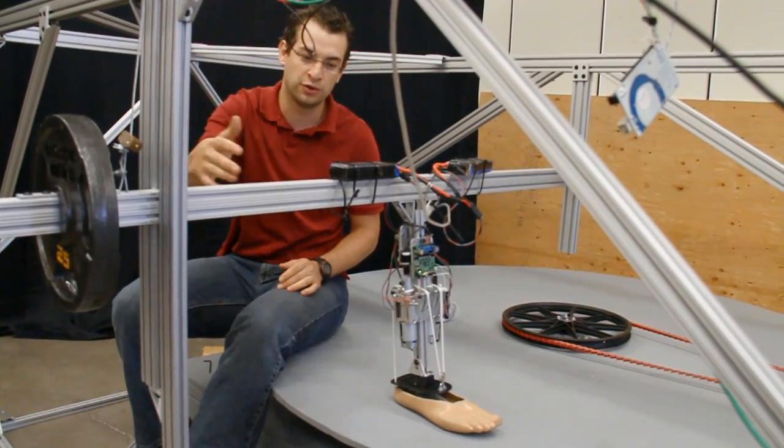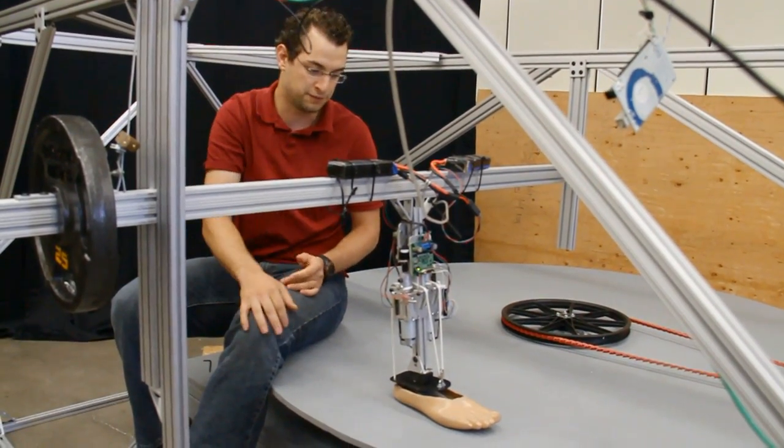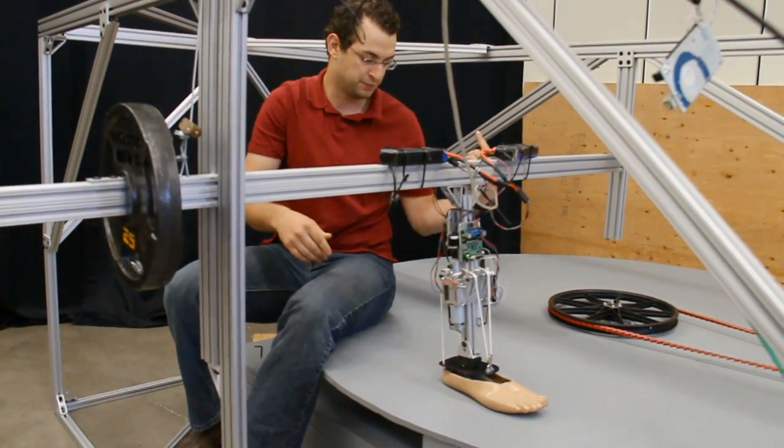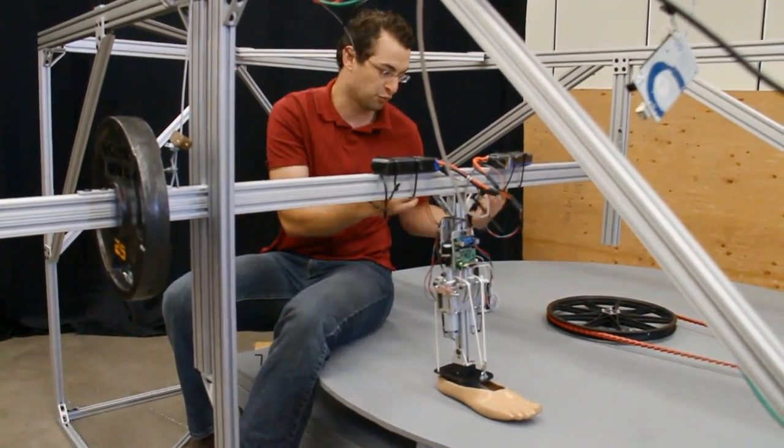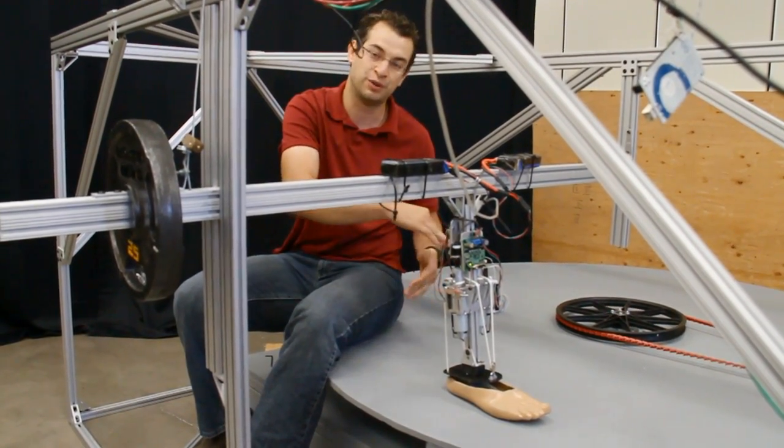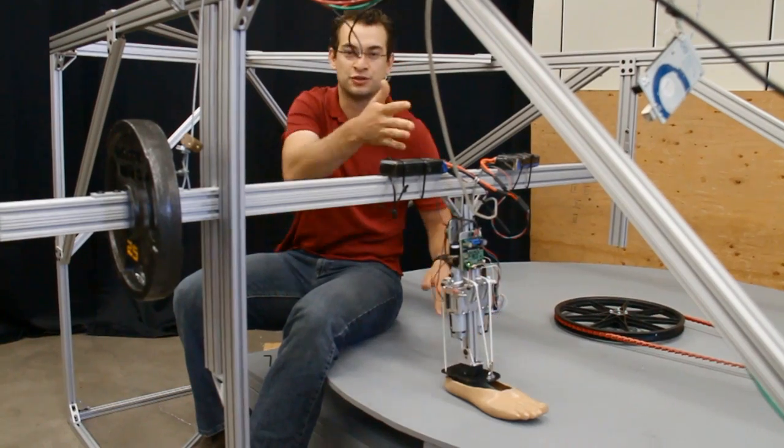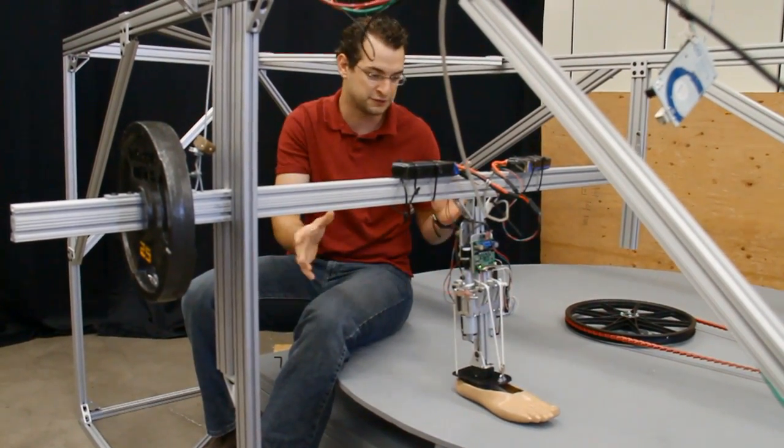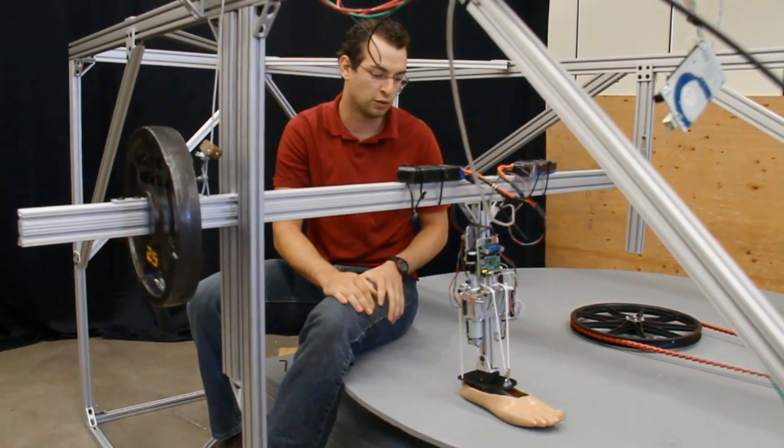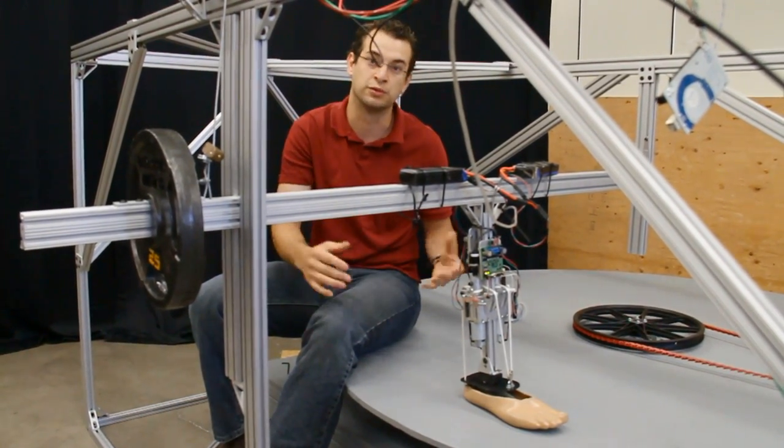This treadmill is capable of loading and unloading the ankle with as much weight as we want by changing weights. We can change speeds, radius of turning, inside or outside turning. We can also add irregularities to the surface to simulate obstacles. We have a lot of flexibility in whatever test we want to do on our prosthesis with repeatable results.